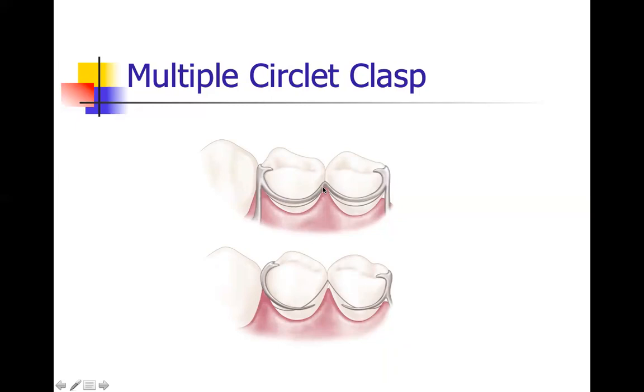It is used when additional retention and stabilization are needed, or in periodontally weakened teeth to splint them together. The disadvantage is that two embrasure approaches are necessary rather than a single common embrasure for both clasps.